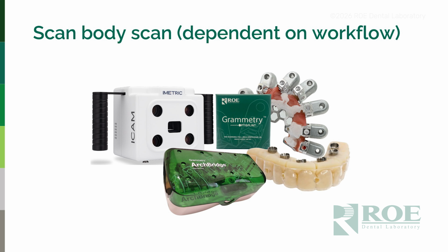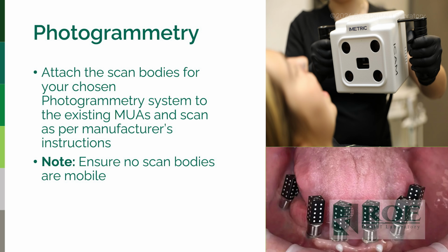And then you've got your scan body scan, and that's obviously dependent on what option you choose, whether it's Photogrammetry, Optisplint, ArchBridge, or iJig. If it's Photogrammetry, you're going to use the dominoes or the particular scan body of that particular photogrammetry system. It's very important to make sure that these scan bodies have no mobility, that they're not damaged, that they are appropriate to be used, because these dominoes do wear over time, and that obviously is going to add an inaccuracy to the process.